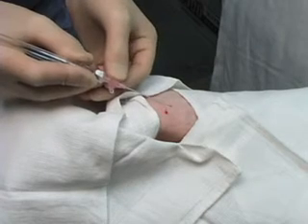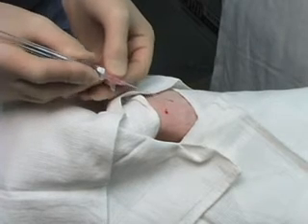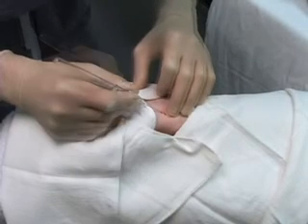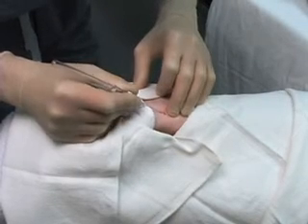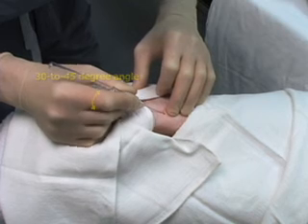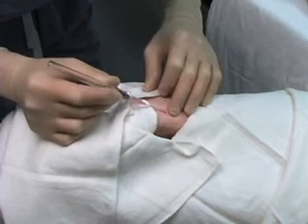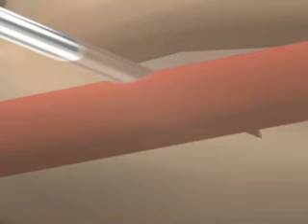In the over-the-wire technique, the catheter and needle assembly are checked first to make sure the catheter glides easily. The assembly is then advanced toward the artery at a 30 to 45 degree angle. When blood return is noted, that catheter is then advanced through the vessel and the needle is removed.